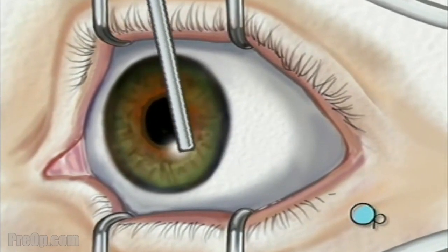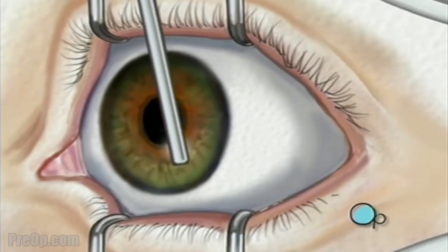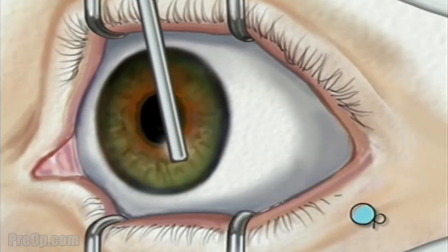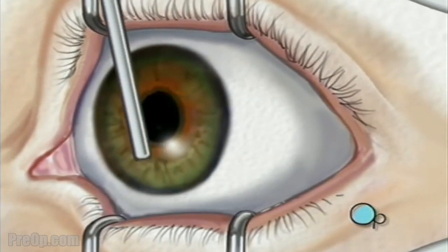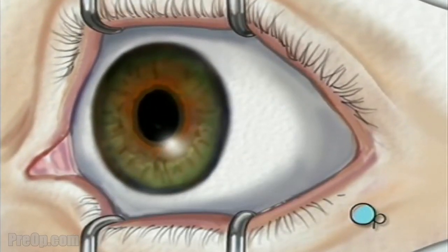When the operative field is numb, the doctor will carefully remove the epithelium, or top layer of cells, exposing the stroma, the non-cellular portion of the cornea.